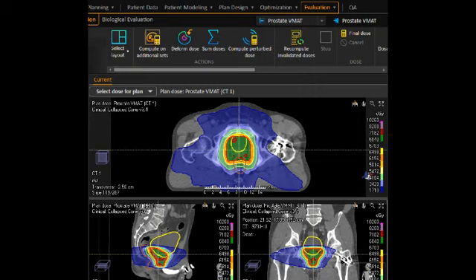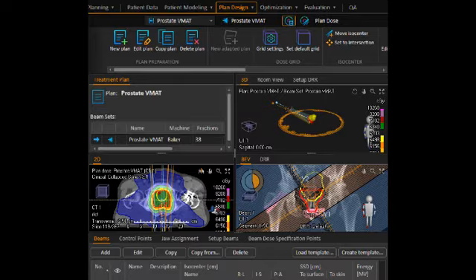All right. Okay, so we're going to start with this treatment plan. You've seen things like this before. And you want to verify that the actual plan, as delivered on the patient, is going to be delivered correctly. That's quality assurance. The problem here is the plan is pretty complex.